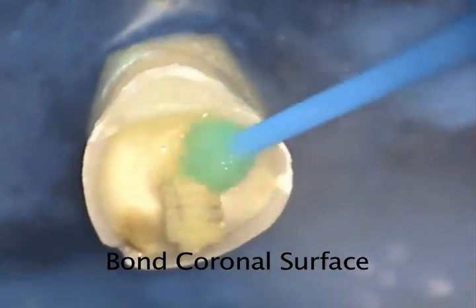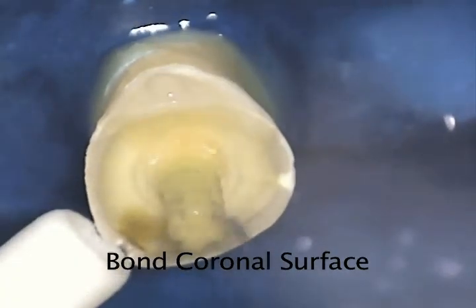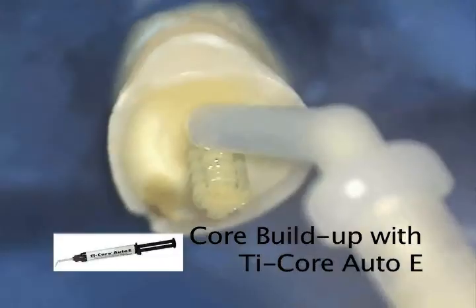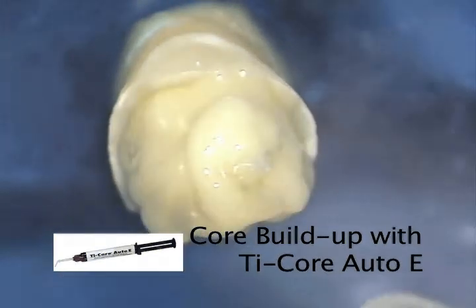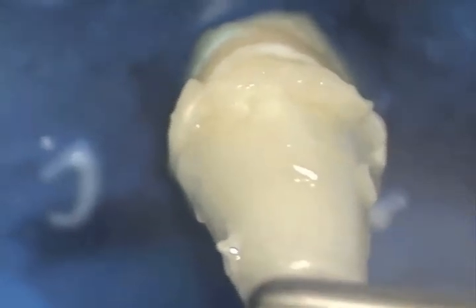Because we are using dual-cured Tycor Auto-E for the core material, we recommend using a multi-step bonding agent. First, we etch the coronal surface with 37.5% phosphoric acid for 20 seconds and then wash it off with water. We then mix the components of the bonding agent and apply the mixture to the coronal root surface, using a self-curing bonding agent and letting it cure on the root surface. We then express dual-cured Tycor Auto-E through a small mixing tip onto and around the post, fill the appropriate size clear core form with more Tycor, place the core form over the post, and remove the excess material. We cure for approximately 40 seconds per 4mm increment of material, adding a little extra time since some of the light is absorbed by the clear core form. The core form is then removed and the core can be prepared to its final shape.